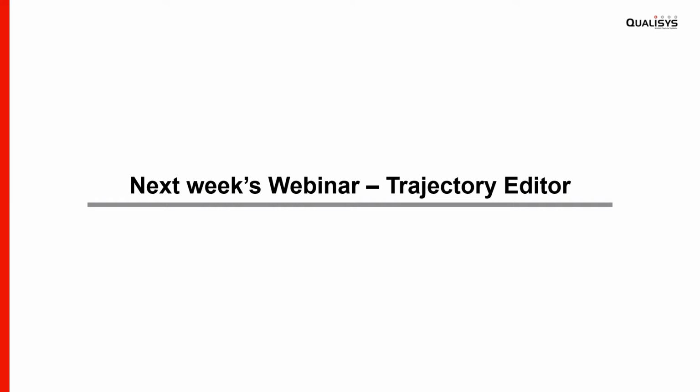The next question: do you plan to have the same concept for the clinical gait? That's a good question. It's not a problem, but the marker set that we have right now is why we call it the sports marker set, Alberto. For gait, people have different guidelines to create the marker set.